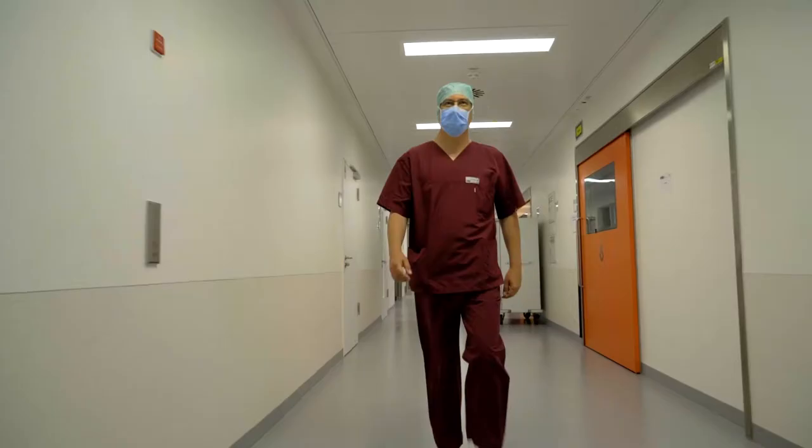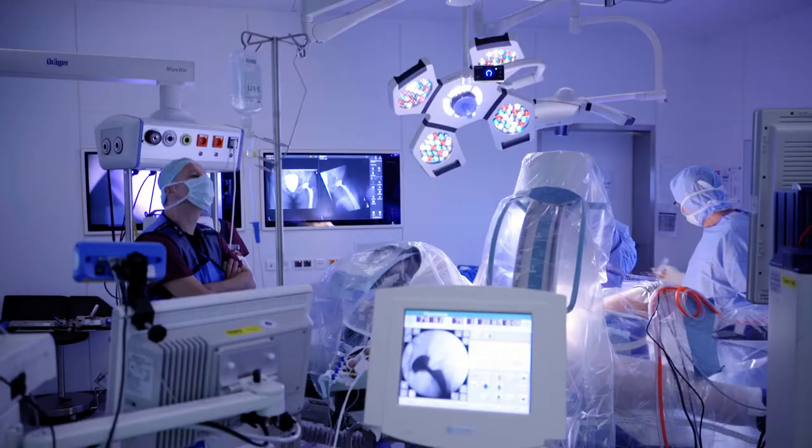Our new centre opened in 2014. It includes 32 operation rooms for our inpatients. Four of the rooms are fitted as modern hybrid operation rooms.